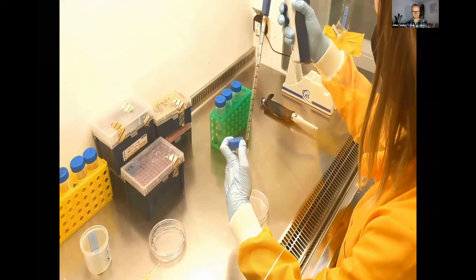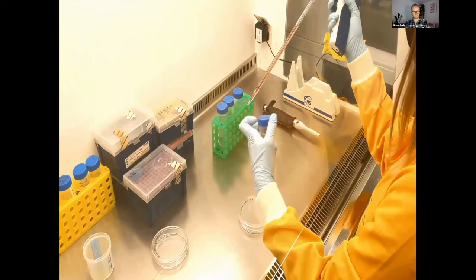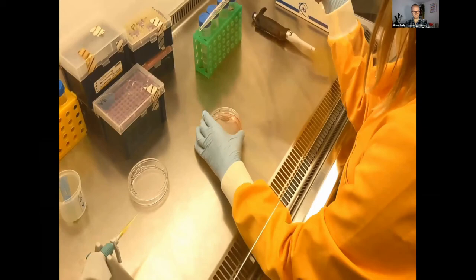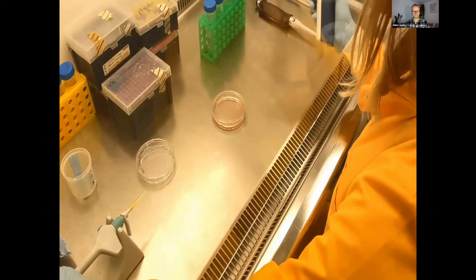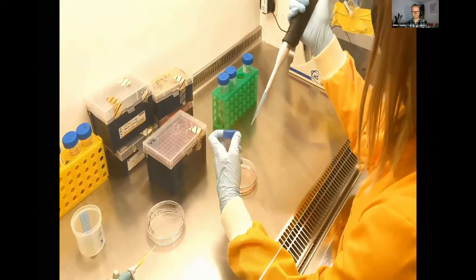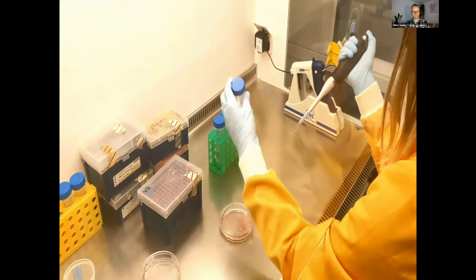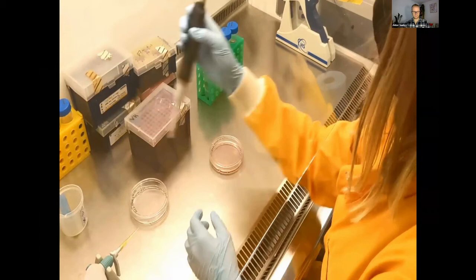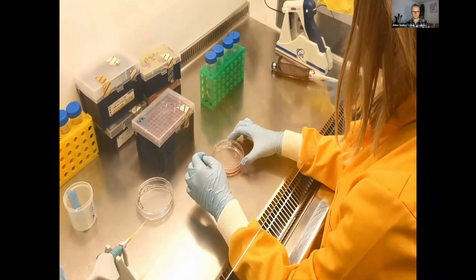To a new culture plate, the researcher adds fresh growth media. She distributes it across the surface of the plate. Going back to the Falcon tube containing the resuspended cells, she takes a small fraction of its volume, containing only a small number of the original cells, and adds this to the new culture plate. She gently mixes the replated cells and the media to evenly distribute the cells across the plate.